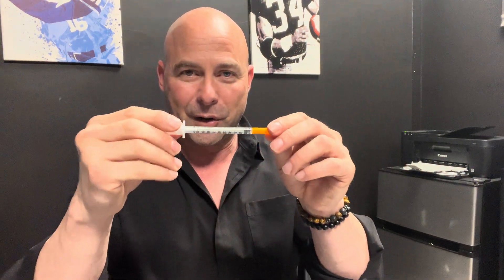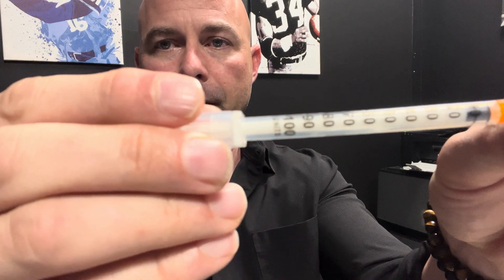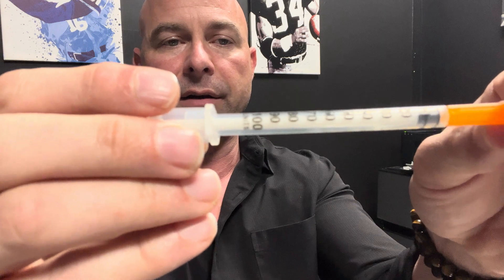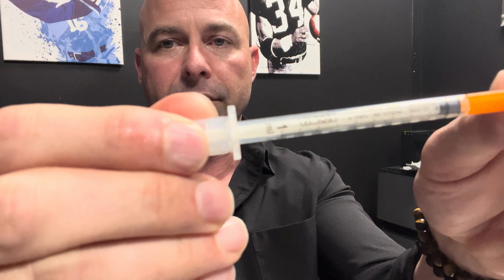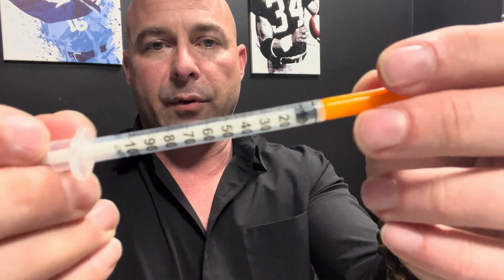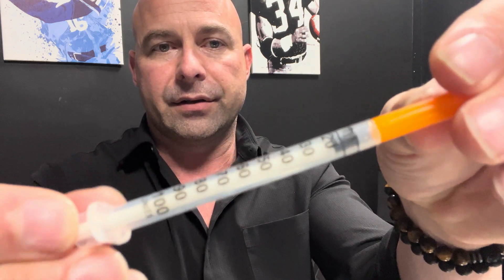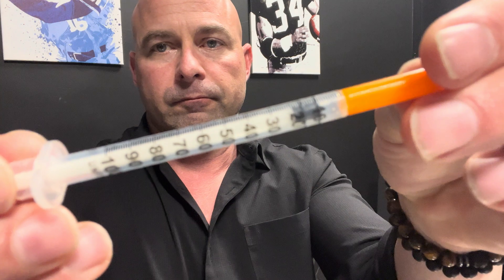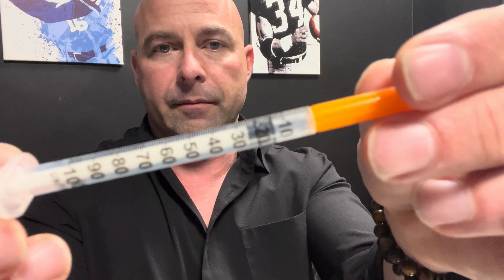More confusion comes with these syringes — notice it has units on there, up to 100 units, because this is an insulin syringe. In the world of insulin we use units, but this whole syringe is also one milliliter. So when we say 0.1 milliliter, we're bringing it back to the 10 mark — that's one tenth of the whole milliliter. If it's 0.15, we'd come back in between the 10 and the 20.